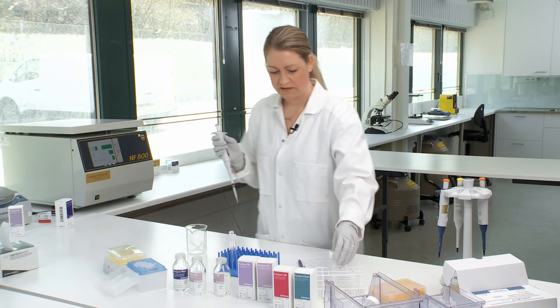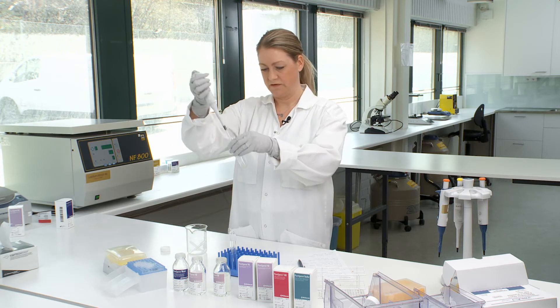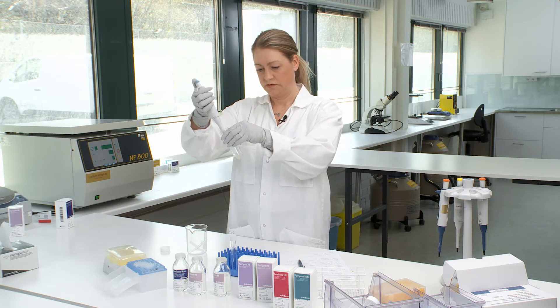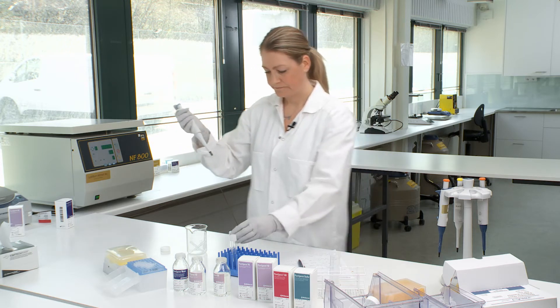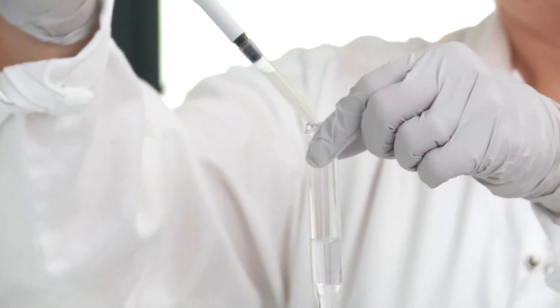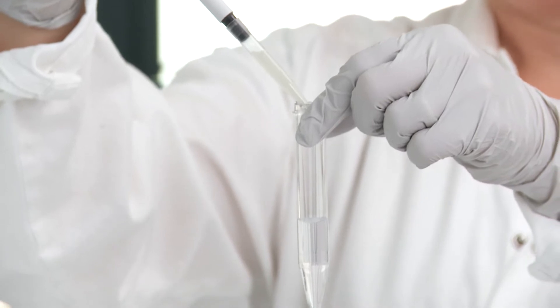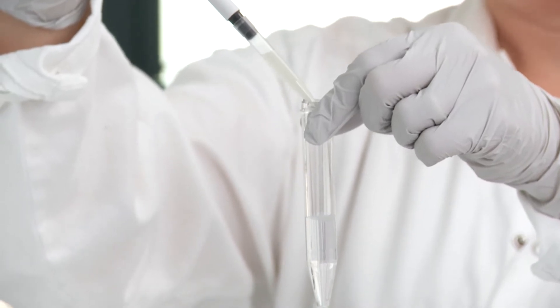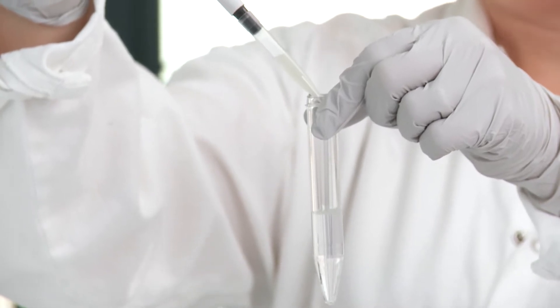You then take your semen sample and carefully layer it on top of the two previous layers. The maximum amount of semen we recommend putting on top is one and a half milliliters. Otherwise you risk getting an overloaded gradient and you get immotile sperm in the pellet.